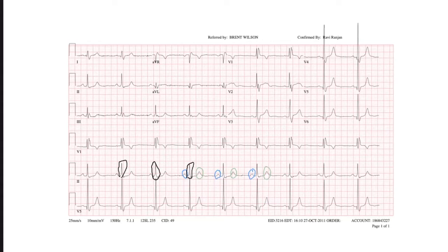What's not normal? The first thing that draws my eye is the peak of the QRS seems way taller than it should be. Yeah, so when I said that, Robbie said we don't pay much attention to amplitude unless it's more so in the T wave, not so much in the QRS.